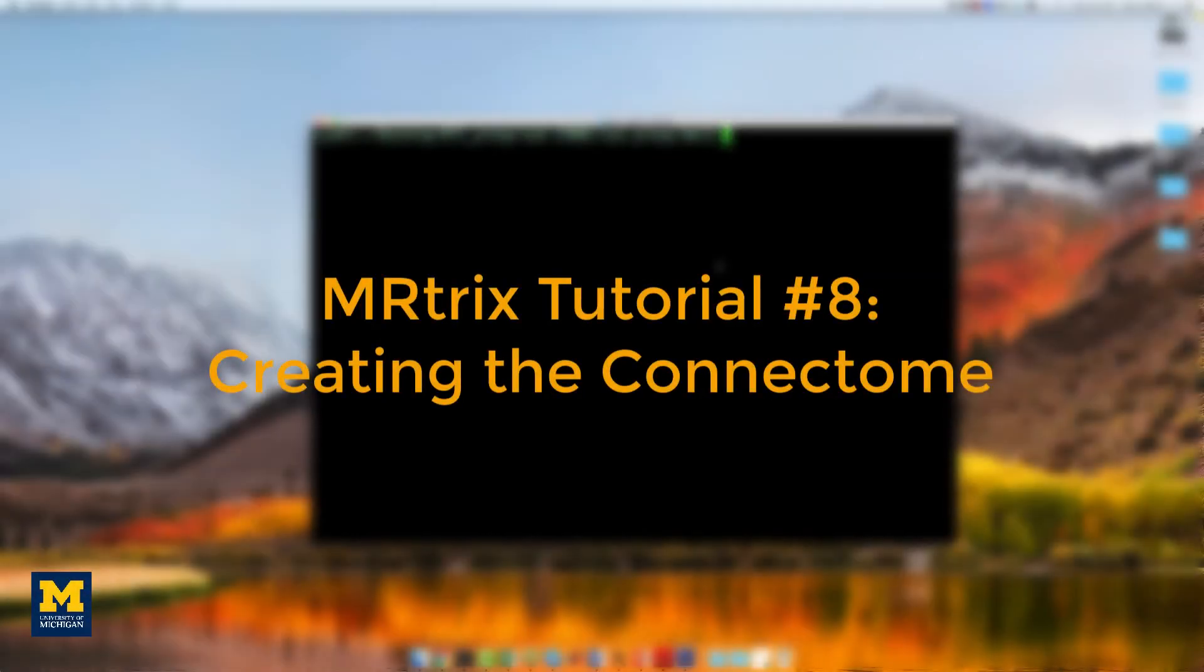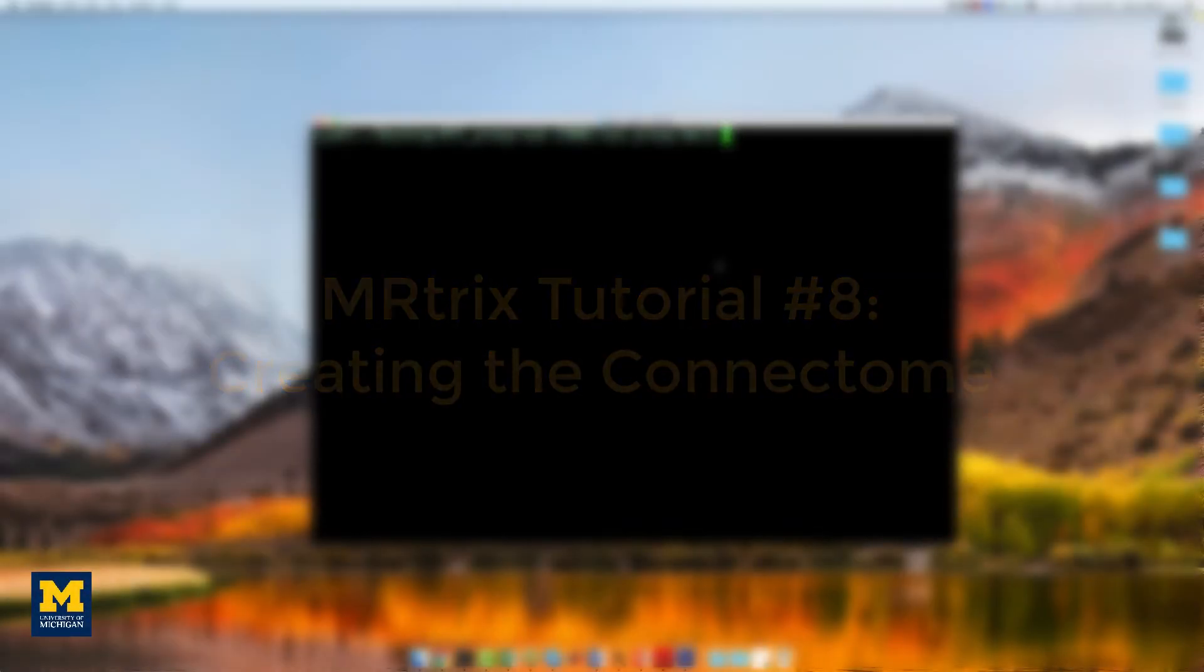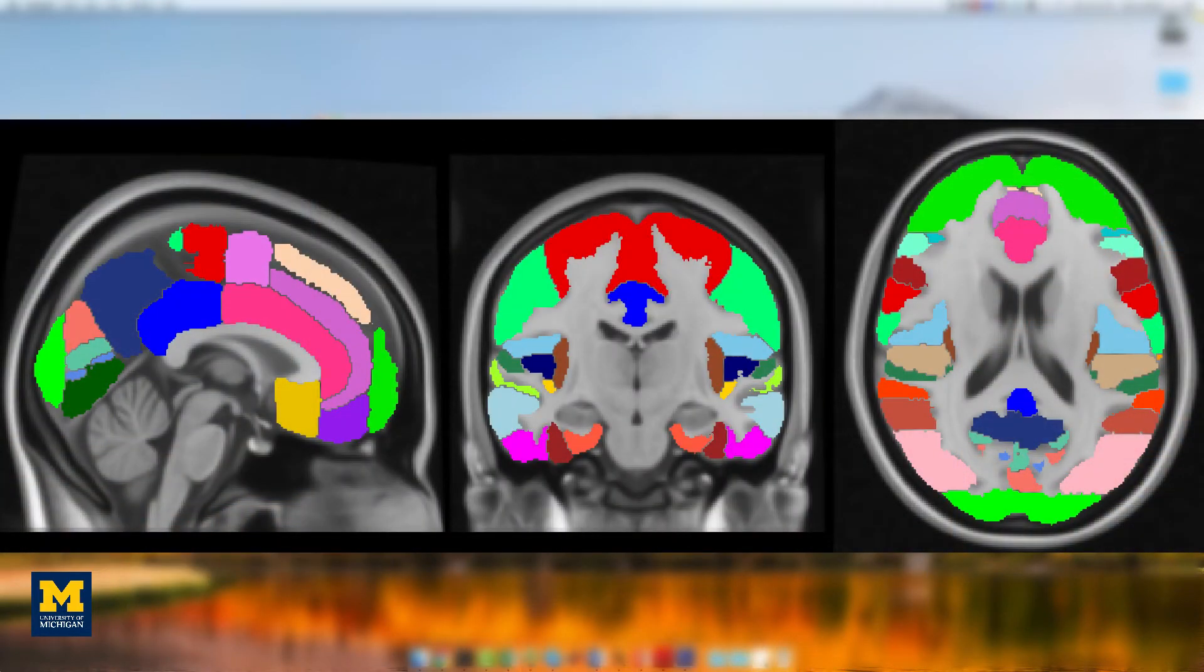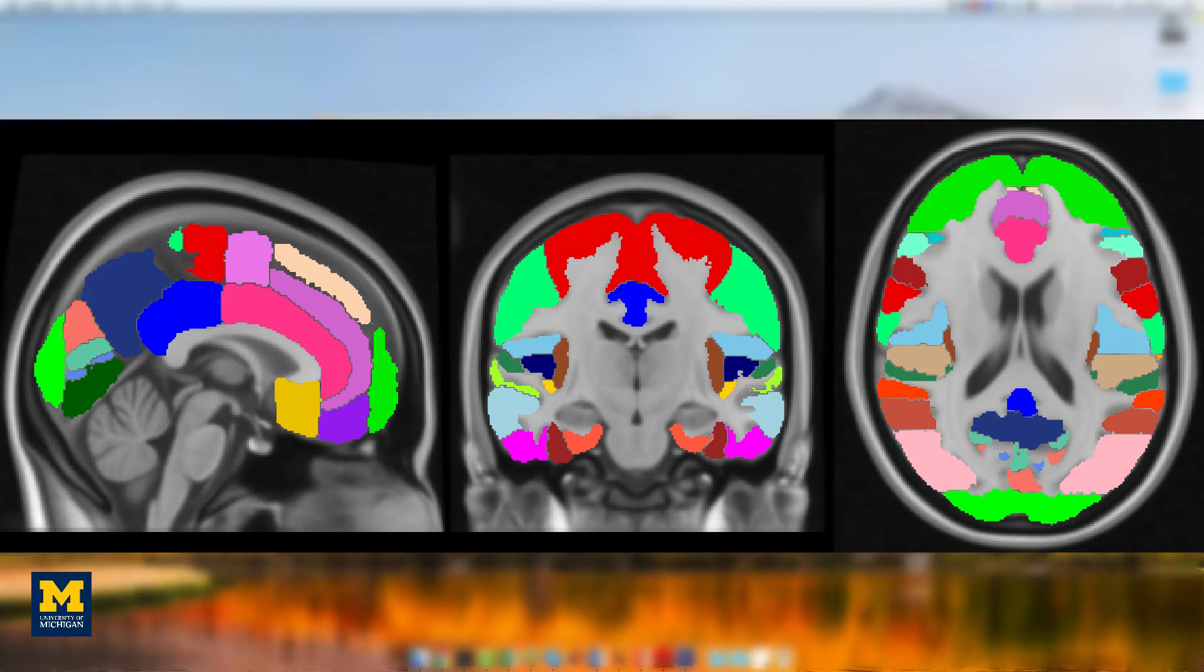Now that we have created a streamlined map, we can create a connectome that represents the number of streamlines connecting different parts of the brain. In order to do that, we have to first parcellate the brain into different regions or nodes. One way to do this is by using an atlas, which assigns each voxel in the brain to a specific node.